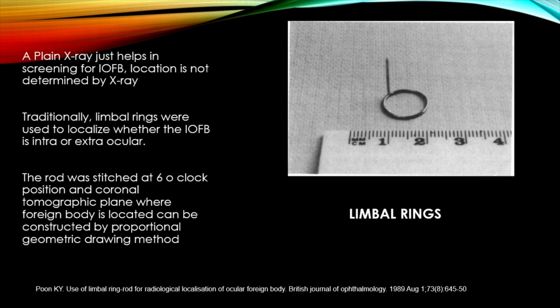Basically, it has 2 objects which are kept in front of the eye, and then the X-ray is taken at 2 different angles. And using the angle and the distance of the fixed objects and the intraocular foreign body, you can gauge whether the foreign body is inside the eye or not. All this is history. Nobody uses it now.